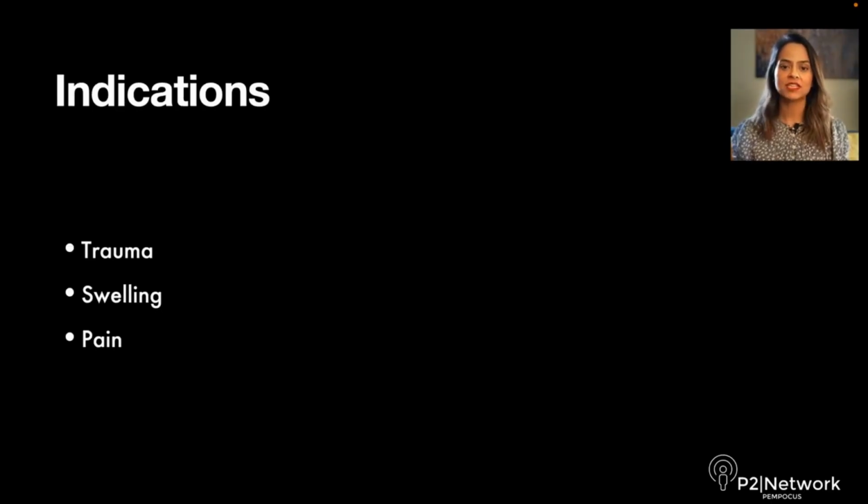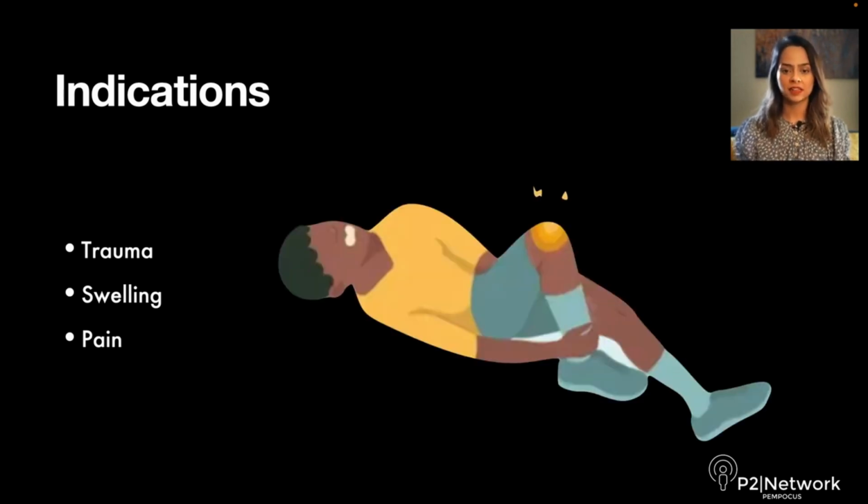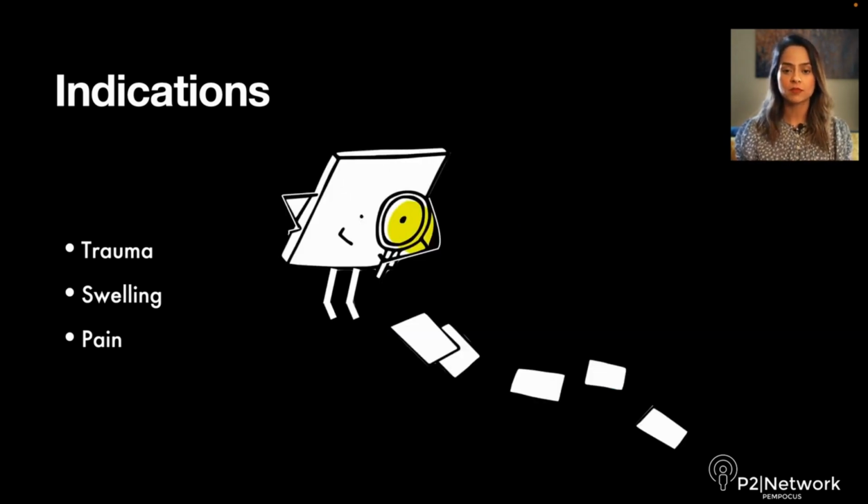Knee ultrasound is extremely useful while evaluating for knee pain and swelling. The knee is the most commonly injured joint by adolescent athletes, with an estimated 2.5 million sports-related injuries presenting to the EDs annually. It is also one of the commonly affected joints in septic arthritis. Ultrasound may detect effusions as small as 7 ml in the knee joint space, and in one study had a sensitivity of 91.6% in detecting effusions when compared to MRI.